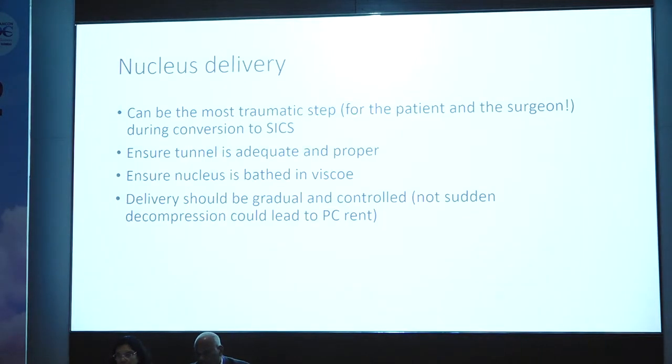And the nucleus delivery and all the various ways we saw is the most traumatic step for the patient and the surgeon, especially when we are learning SICS or when we are converting from phaco to SICS for whatever reason. So the tunnel has to be adequate and proper. See that the nucleus is bathed in visco, and nowadays we have excellent viscoelastics.